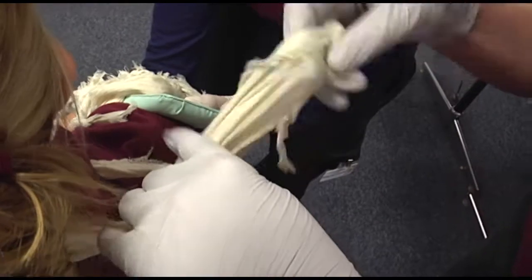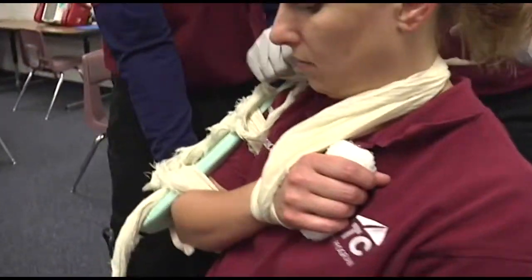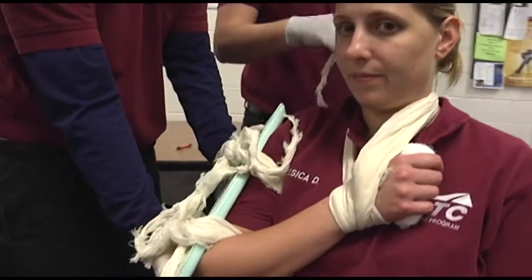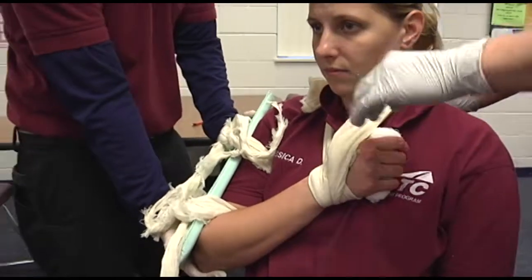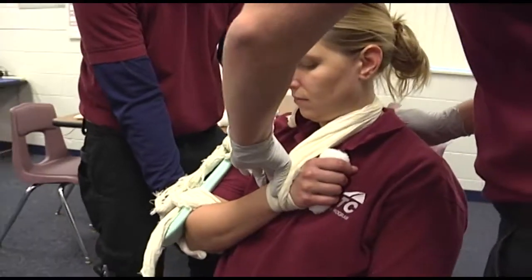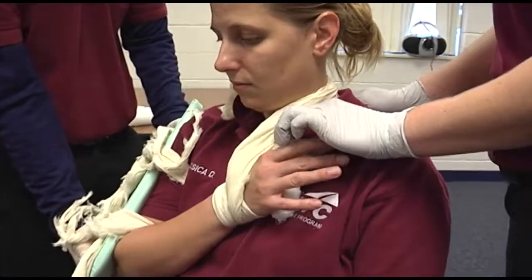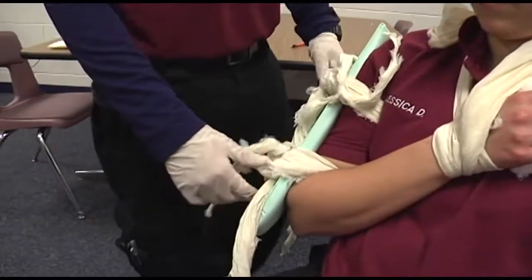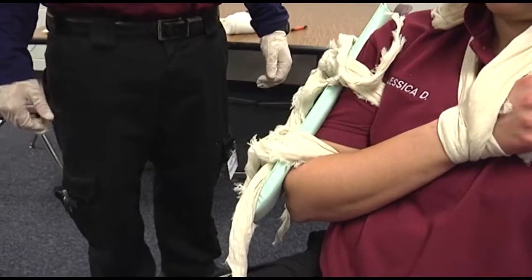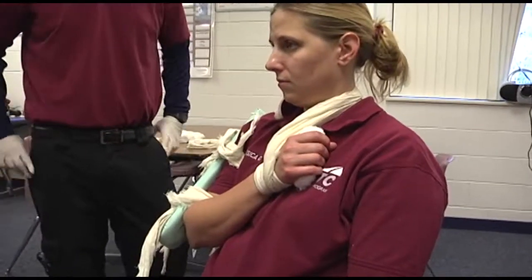Elevate the hand and immobilize the shoulder. Check and record the status of circulation, movement, and sensation. Loosen the splint if necessary to maintain circulation. Transport the patient in the sitting or semi-sitting position as the patient's condition permits.